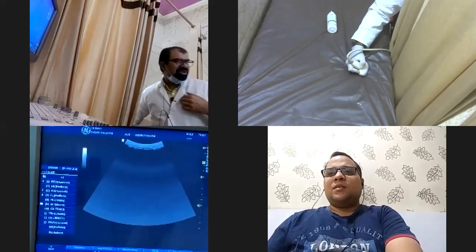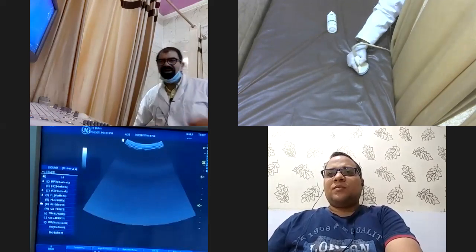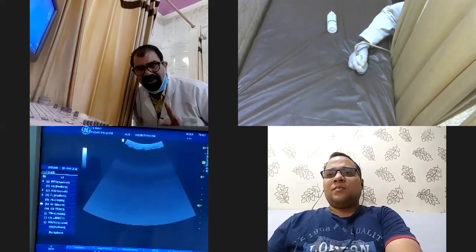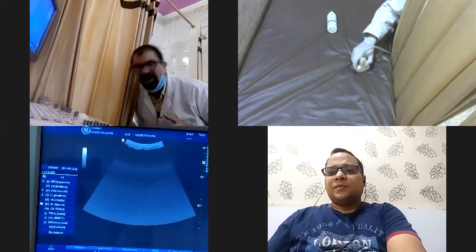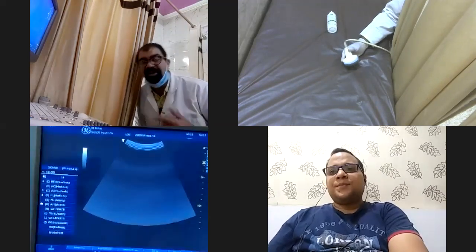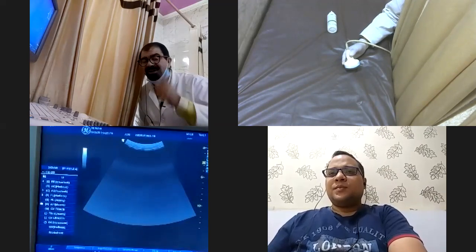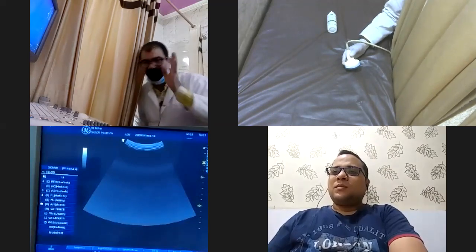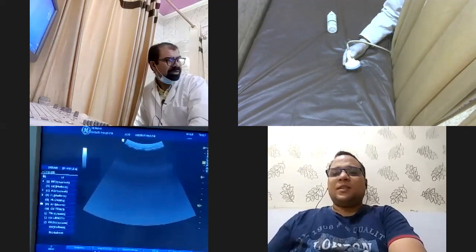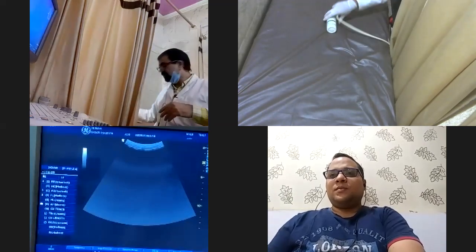Yes, sir. I personally am comfortable with anti-clockwise rotation, but again, I'm repeating, I am leaving it up to you whether to rotate clockwise or anti-clockwise. You will see yourself what you are comfortable with, but provided you know what you are doing and how that will tell on the screen orientation. Done? Clear? Yes, sir. Now, let me take one patient. I will show you on the patient.